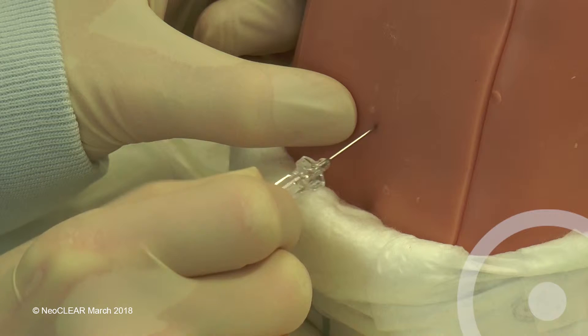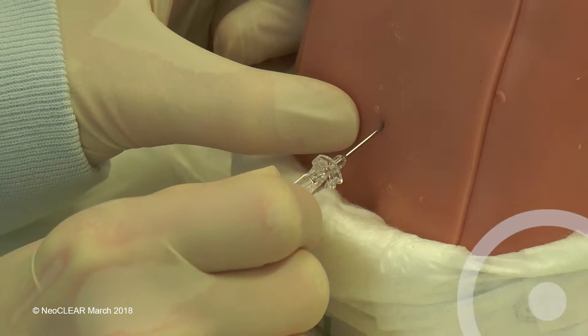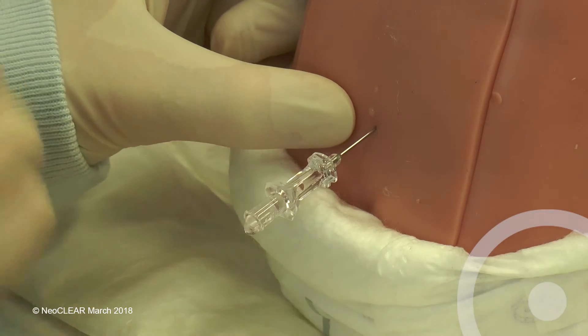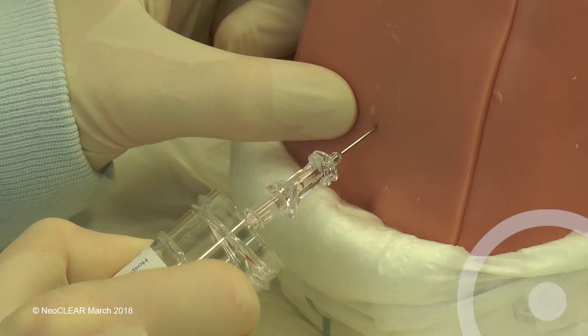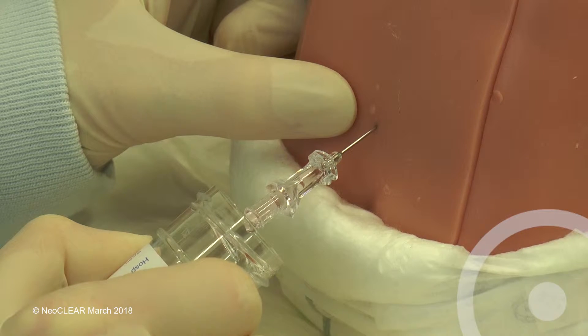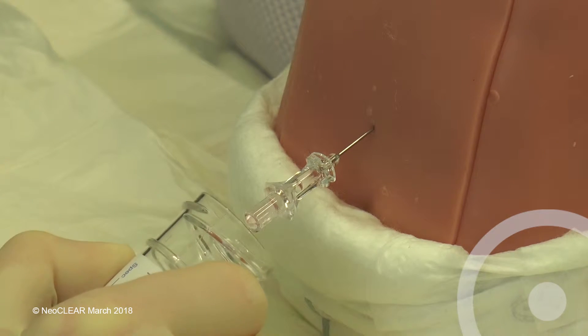If CSF is not flowing, consider rotating the needle to face the bevel towards the head, massaging the fontanelle, or slowly advance or withdraw the needle depending upon the position. Aim to collect into each sterile pot five drops in a preterm baby and eight drops in a term baby.